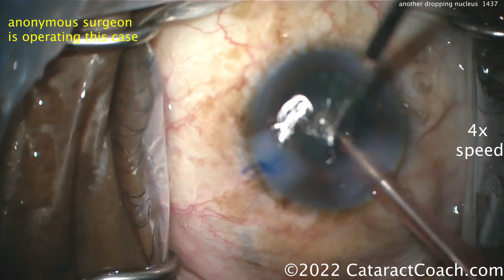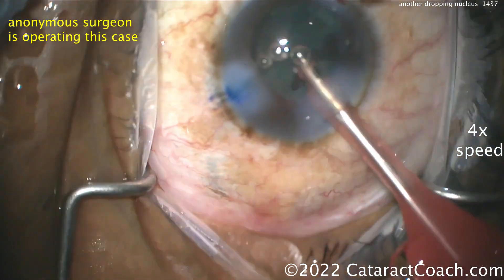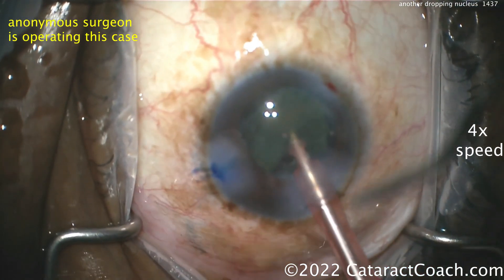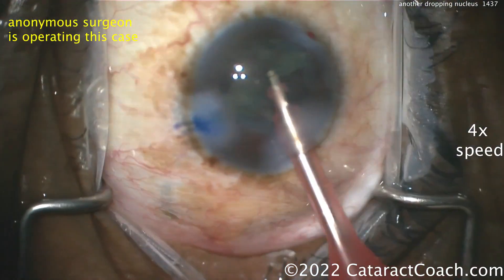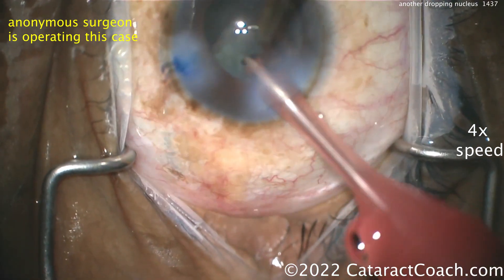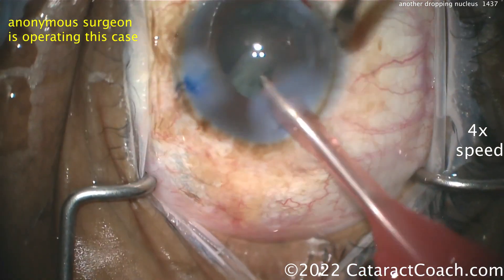Poor followability — another bad sign. It's already in the vitreous, falling into the mid-vitreous. This is not something you can chase after. Once a piece of nucleus is engulfed in vitreous, you can't chase it, because you're going to put a ton of traction on that vitreous and that's going to cause a detachment.